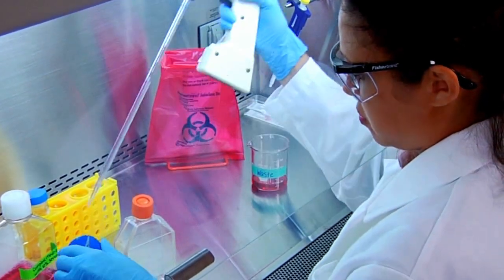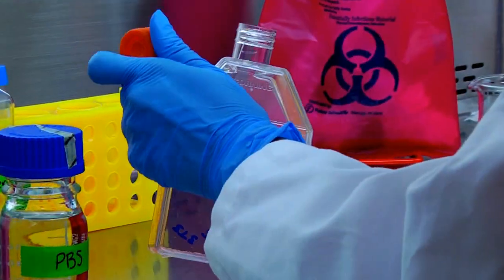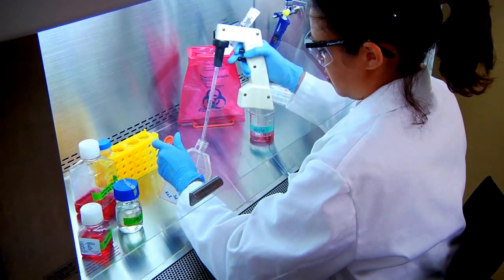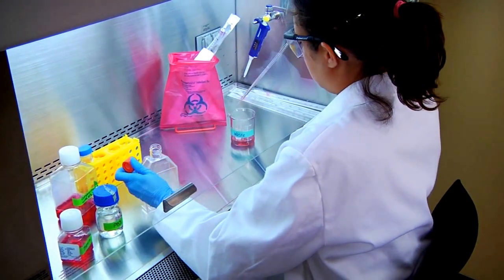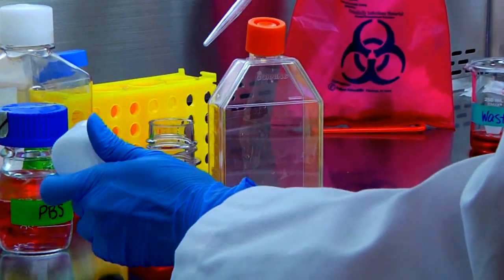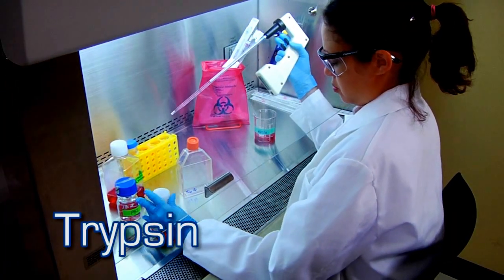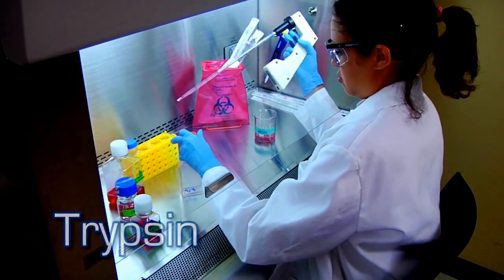Briefly rinse the cell layer with 5 milliliters of sterile PBS to remove all traces of the serum, which contains a trypsin inhibitor. Add 3 milliliters of trypsin solution to the T75 flask.